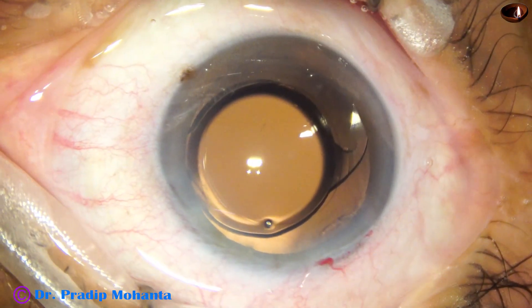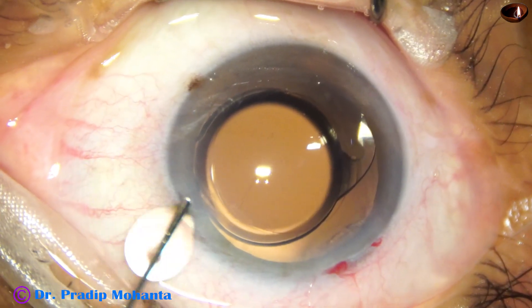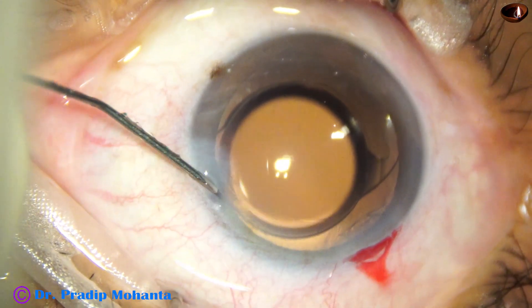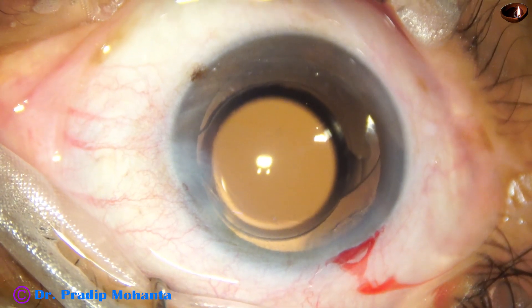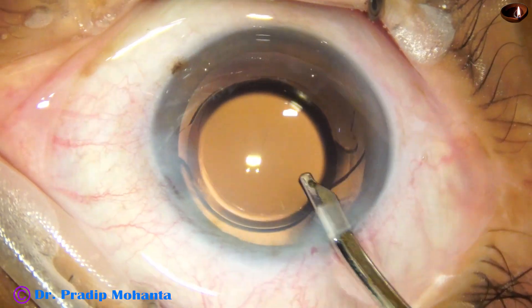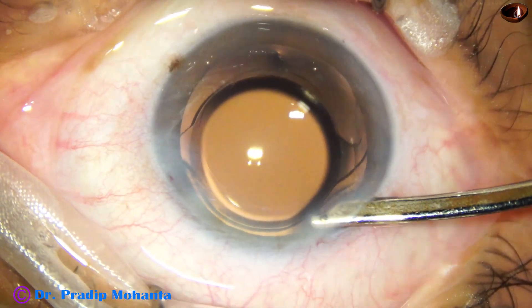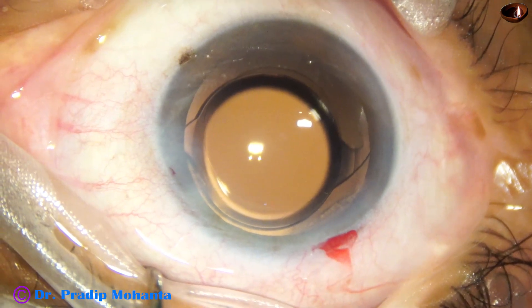See the polishing of the posterior capsule — very clean, no cells sticking to the posterior capsule. This is Moxifloxacin. The side port is closed by corneal stromal hydration, and the main port will not require any hydration. I am going to use a 23G Simco for formation of the anterior chamber. Final lavage of the anterior chamber — at this time fluid is directed towards the cornea for a few seconds to remove any visco that sticks to the corneal endothelium, and this is how I form the anterior chamber. The integrity of the wounds is checked with cotton-tipped buds.